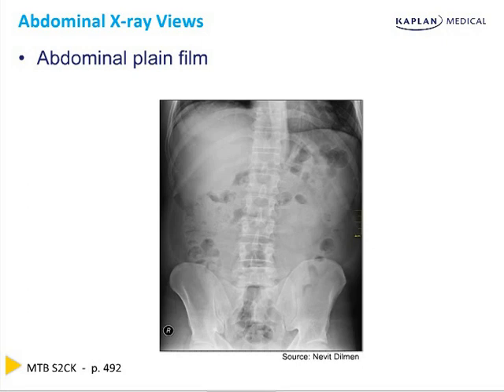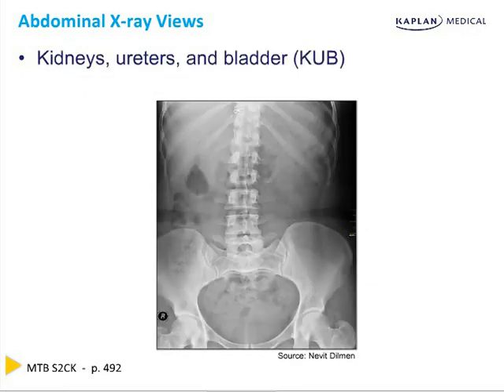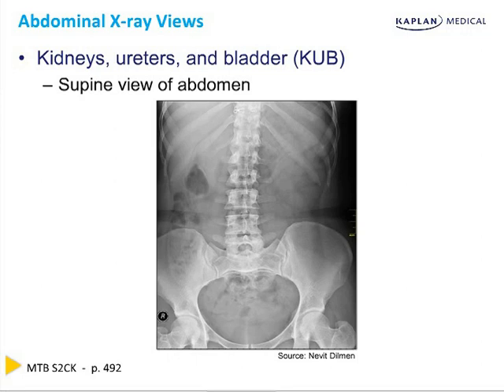There are two standard abdominal X-ray views you should be familiar with. The first is an upright abdominal plain film, which gives visualization of the abdomen and the top of the pelvis. Note the multiple areas of lucency within the abdominal cavity — this is air within the bowel, a normal finding. You may also be able to visualize stool in a constipated patient, but constipation is better diagnosed via patient history and physical exam. The second type is called a KUB film, which stands for kidneys, ureters, and bladder — a supine view of the abdomen useful for detecting dilated loops of bowel caused by a small bowel obstruction.